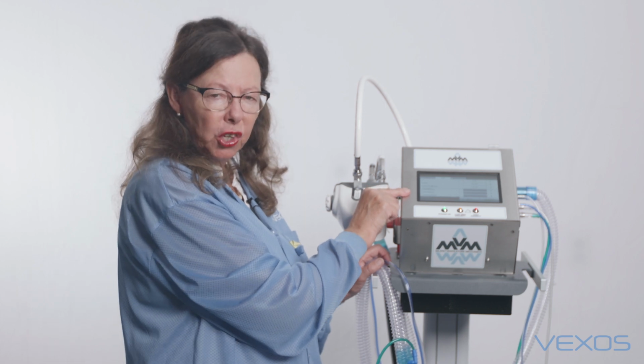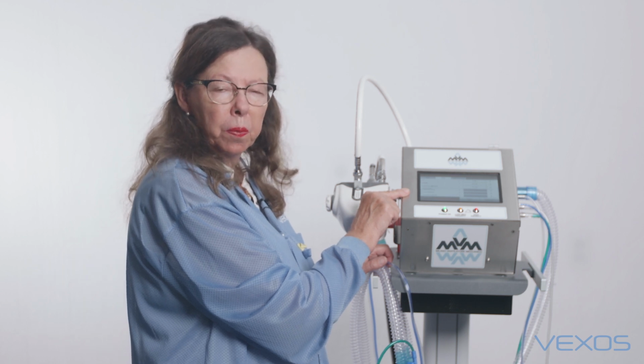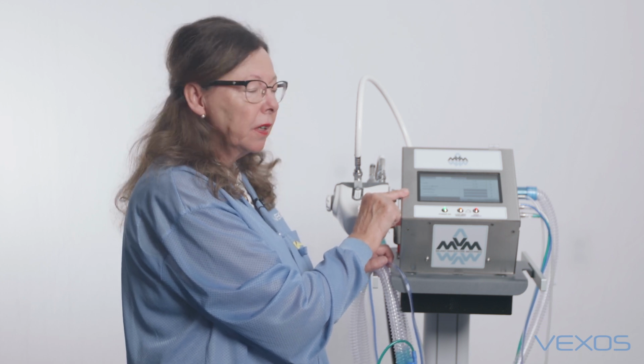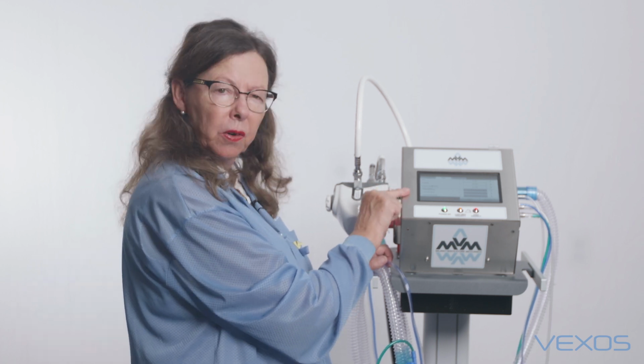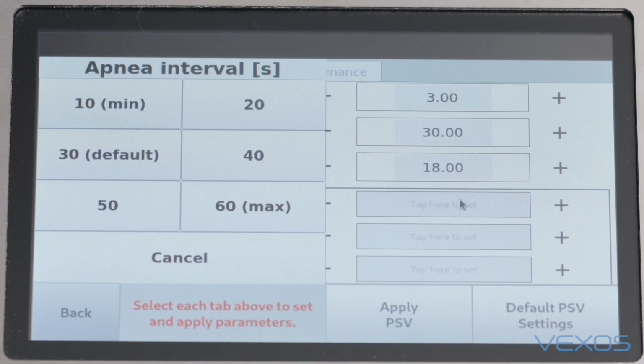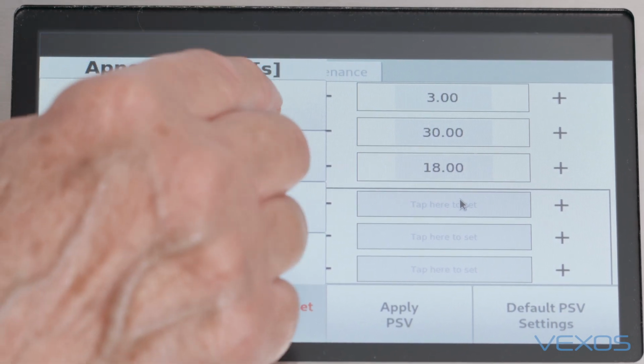There's another section of settings that I must set for pressure support ventilation. These are what is called the apnea parameters. In this mode, if the patient stops breathing, the ventilator will automatically switch to pressure control ventilation. These parameters then must be set. So the first one is the interval. How long will the patient not be breathing before pressure control begins? I'm going to go with the default.